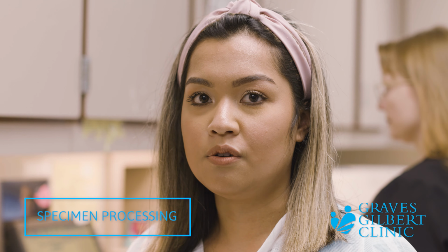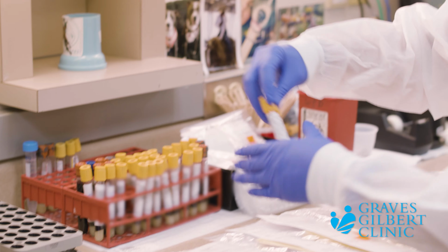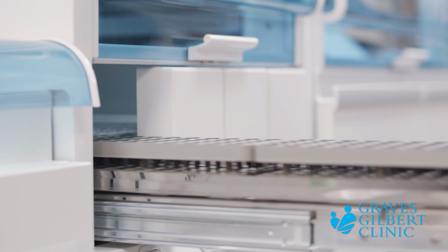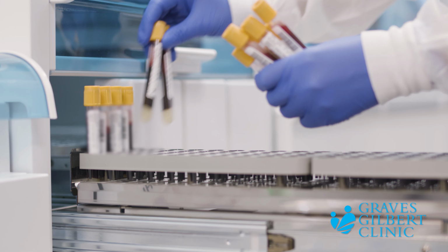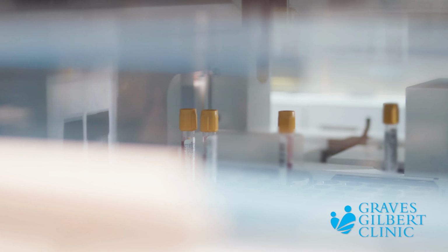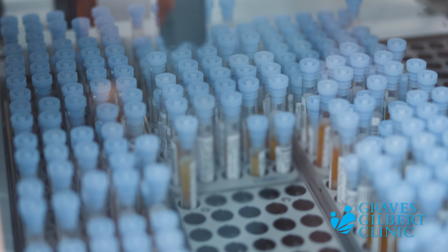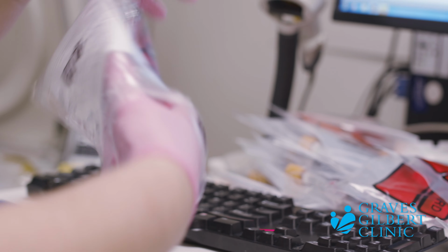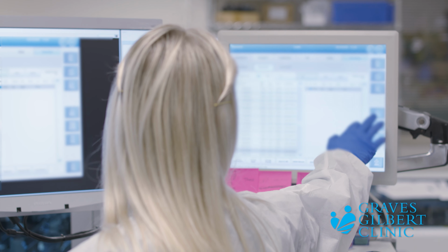We actually receive the blood from the phlebotomist through our windows here, and we wait till our blood is clotted, 15 minutes, and then we put the blood on our analyzer, and this is the 8100 Cobas. So once the specimens come back around and they're resulted, they come back and get capped and put in our analyzer archiving machine right here. And once we archive it, we can put it in our walk-away cooler. We can go and retrieve the specimens in our computer system.